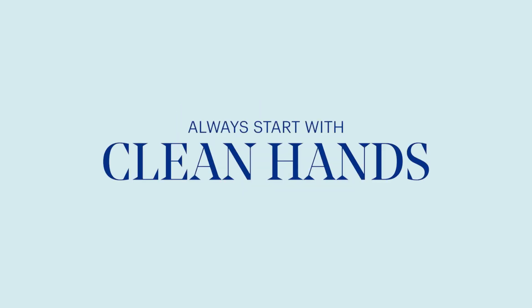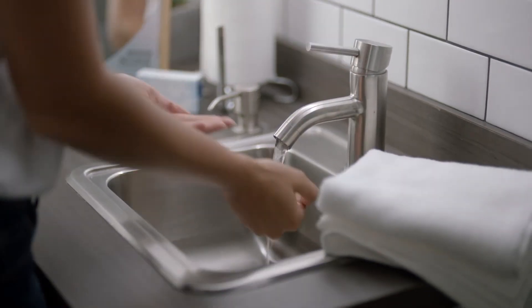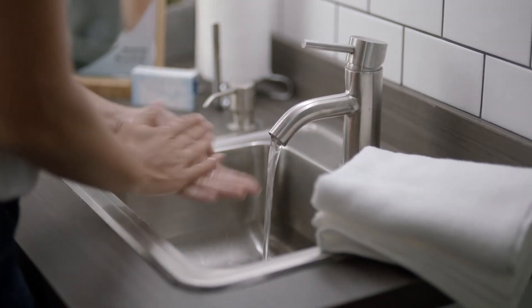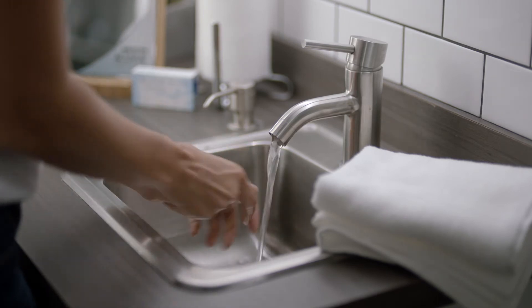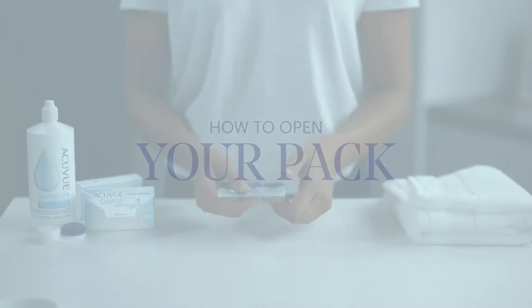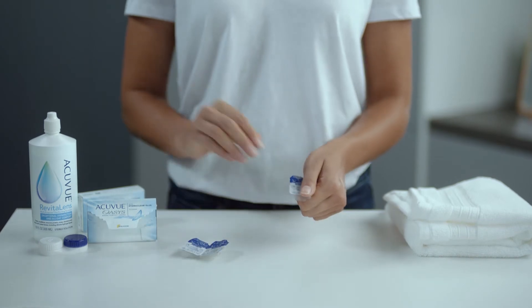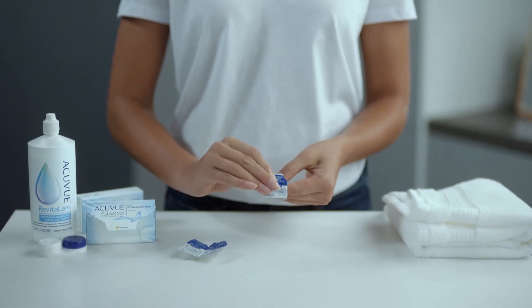First up, your cleaning routine. Always start by washing and drying your hands with a lint-free towel before touching your contact lenses or your eyes — you definitely don't want dirt or germs on either. Now, take your pack of contact lenses and snap the plastic holder for a clean break. Then carefully peel back the foil to reveal the contact lens.